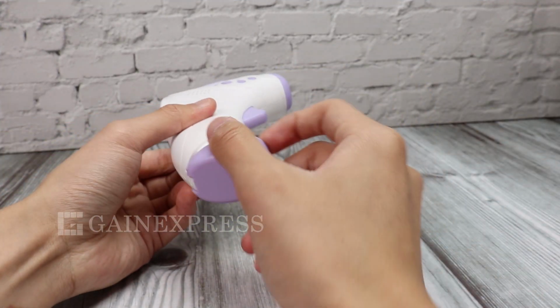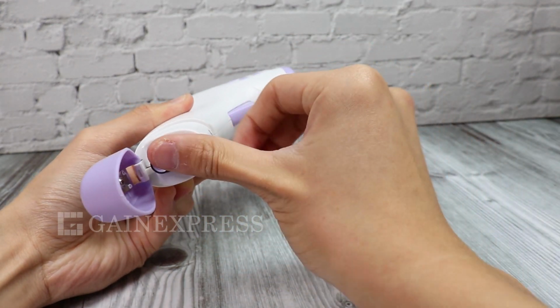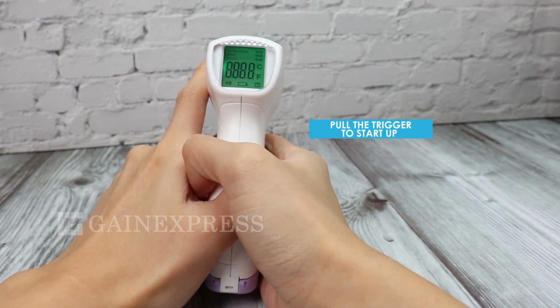To operate, open the battery cover and load 2 AAA batteries. Pull the trigger to start up the meter.